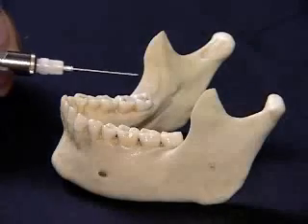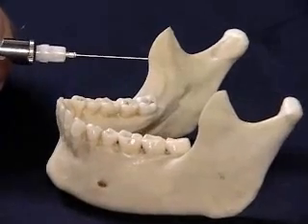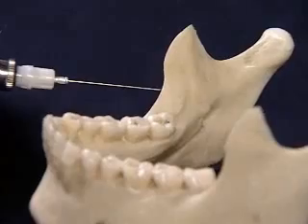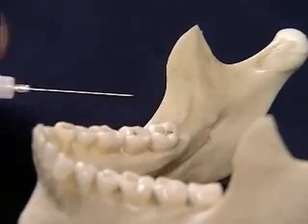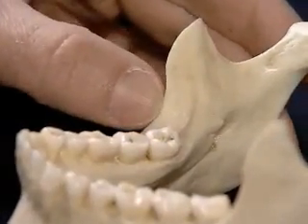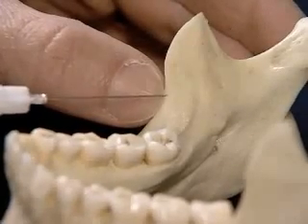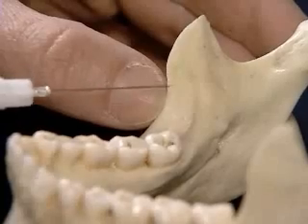You begin by looking at the anterior border of the ramus, shown here, and feeling the greatest depth, which is the coronoid notch of the external oblique ridge. This point should be palpated with your thumb or finger and the greatest depth noted, because that will correspond to the height of injection, which is usually between the midpoint to the height of your fingernail.